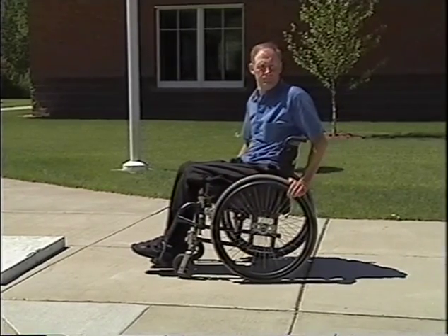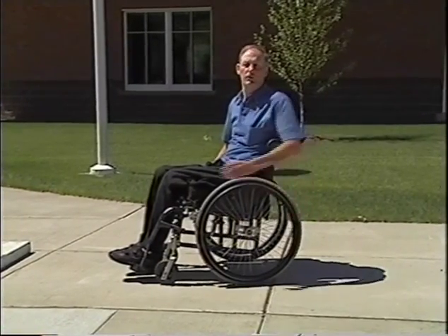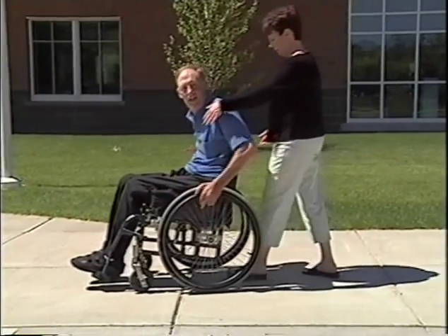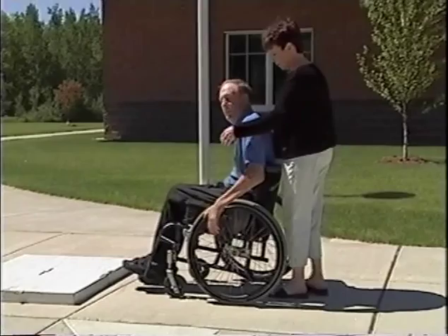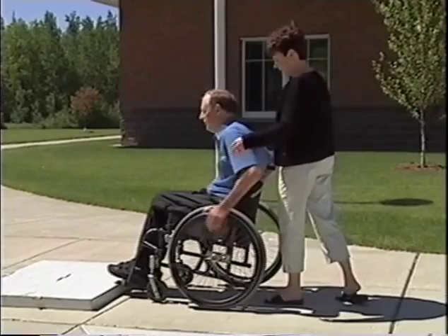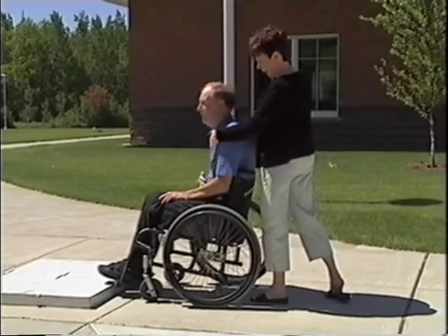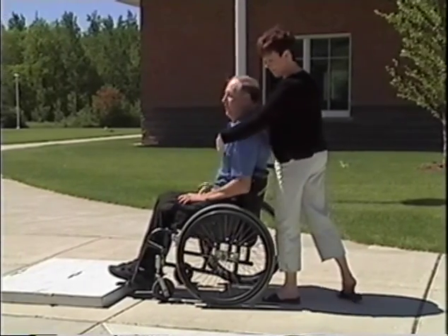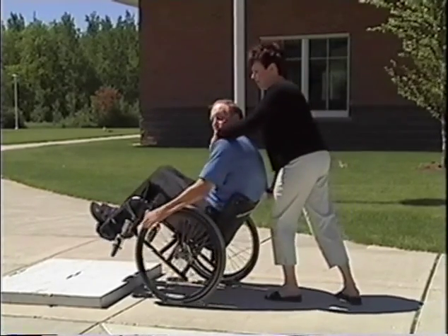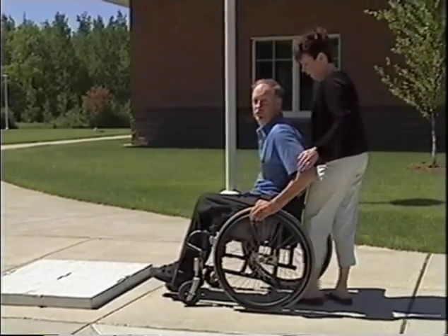When you're teaching this and spotting, you'll put one hand in front and one behind. If somebody hits the curb and bends forward and they have on a body brace, it's going to really cut into them, so as a therapist you'll be able to stop them from falling forward. Or if they fall backwards with too much wheelie, you can catch them. Those are the two things you'll be looking for when you're spotting.